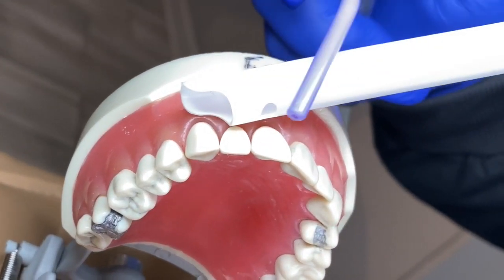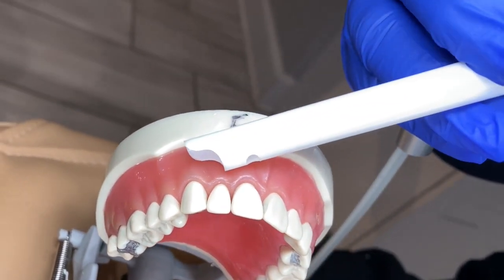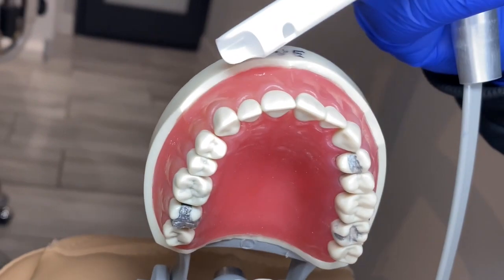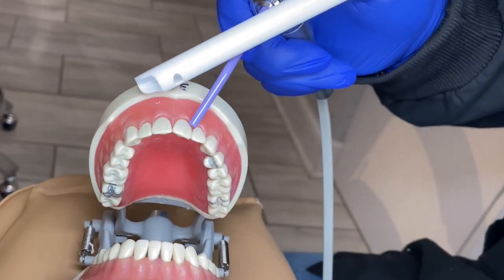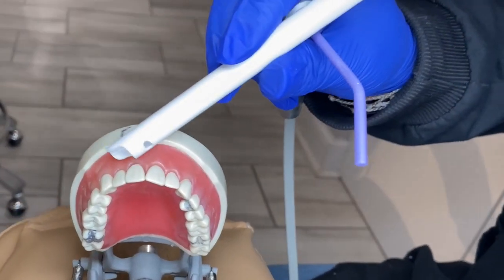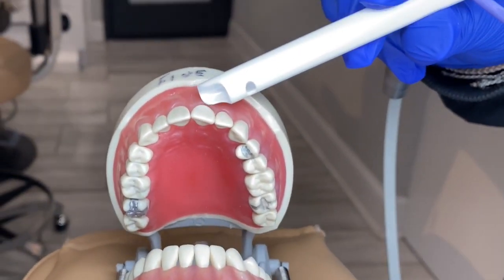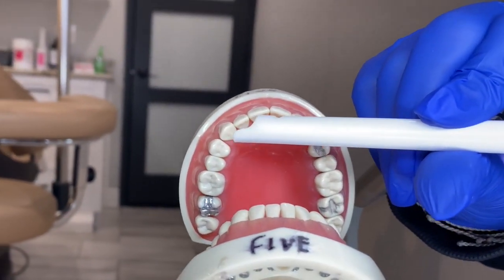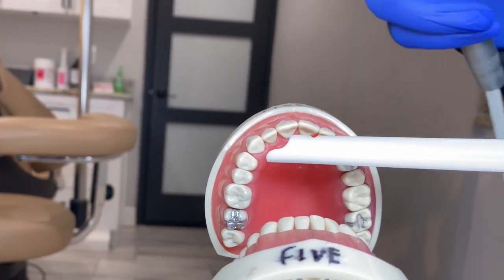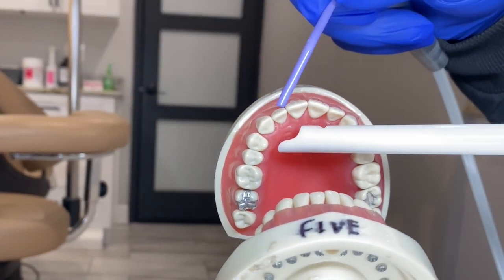Just do not get your suction in the way of the doctor — if you get in the way they're just going to tap your suction and move. Remember, don't press on the gum line. If they're working anywhere in this area, your suction can come anywhere along the gums on the facial, or anywhere along the incisal edge or lingual. Remember, you have a little window, and the tip of the suction is going to be catching all of your water.